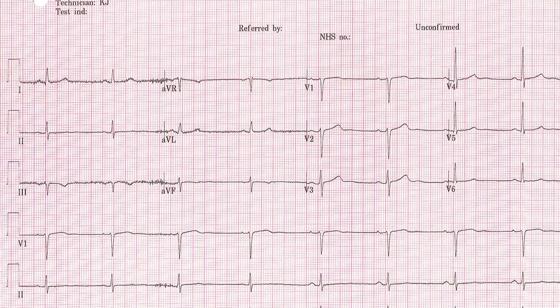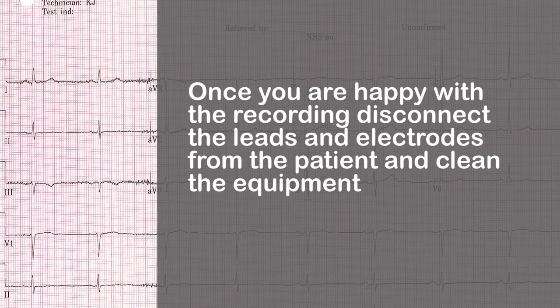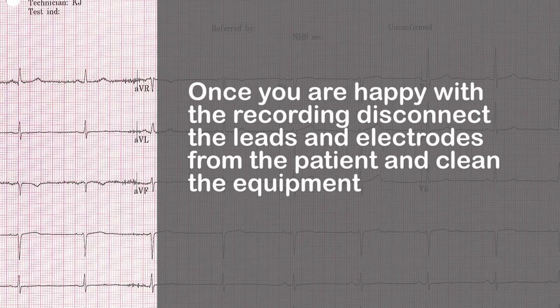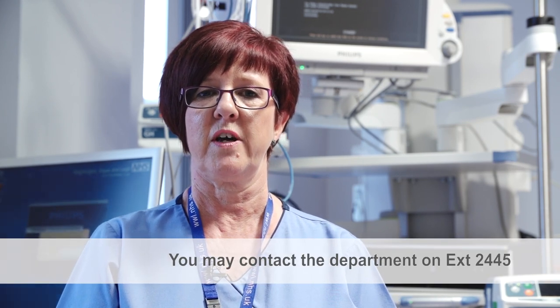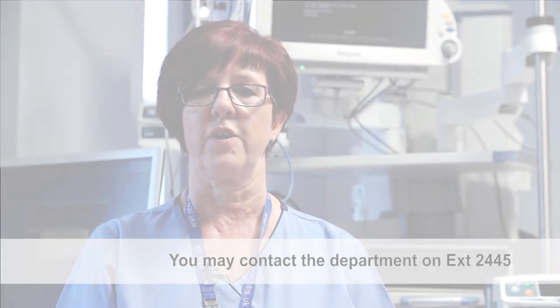Once you are happy with your ECG recording, disconnect the leads and remove the electrodes. Clean your equipment and then pass your ECG to the requesting clinician. This concludes part 1 of the ECG training podcast. If you would like to contact the department for any further training, please ring extension 2445. Thank you.